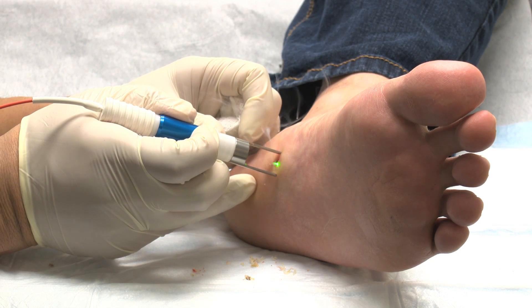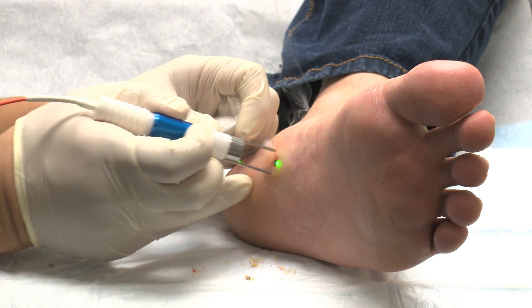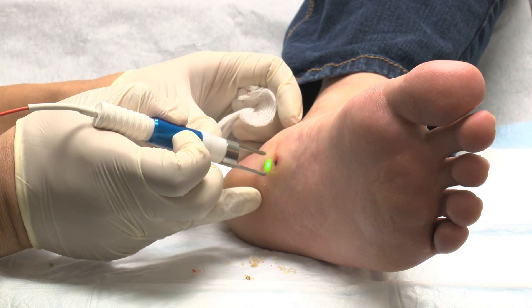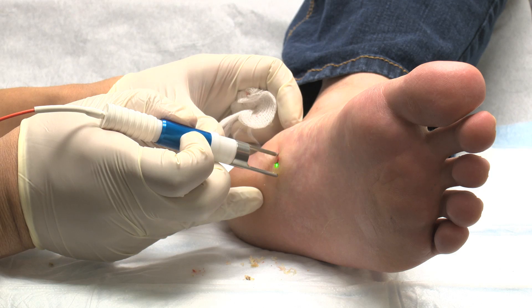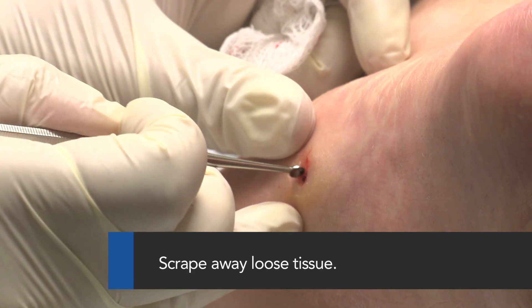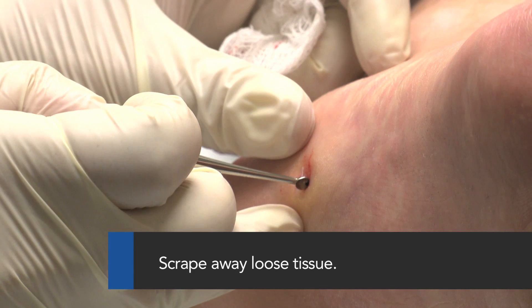Hold the handpiece so that it is just touching the skin, moving slowly over the treatment area. Use extra caution during the patient's first treatment. Pause regularly in order to control progress and patient comfort. You can use a scraping tool to clean away any loose tissue.